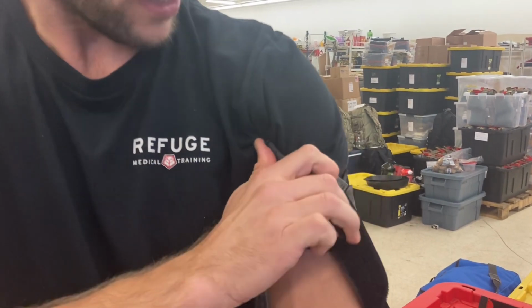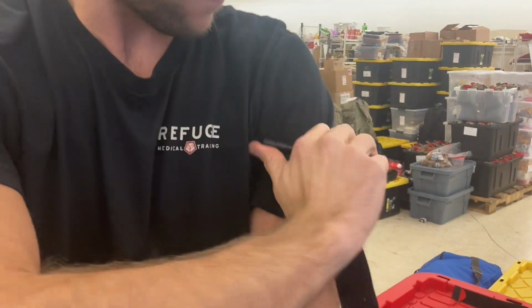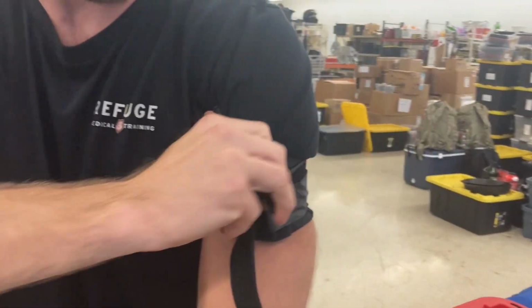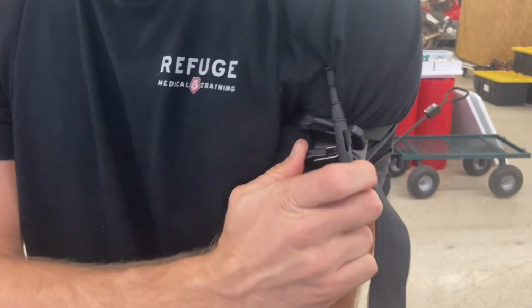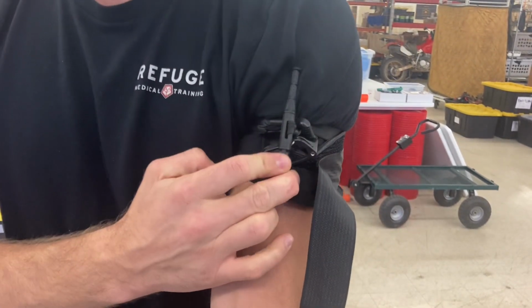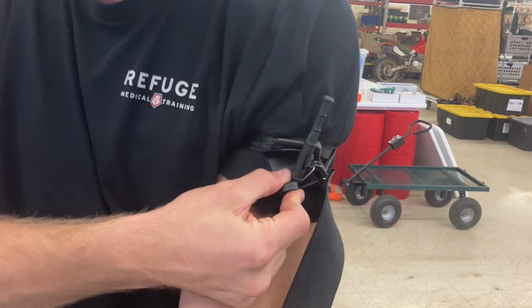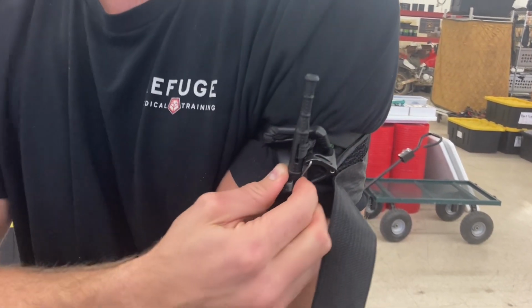Now, when I go to twist the windlass, get that out of the way. It's very small, just now getting to arterial compression. Look at that. I don't understand how this is going to work. This isn't even on my leg this time, and you saw it from start to finish. It will not work. And the whole time I'm assuming that I'm bleeding too.